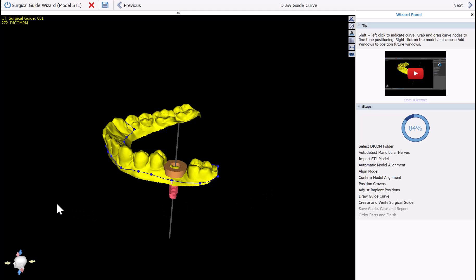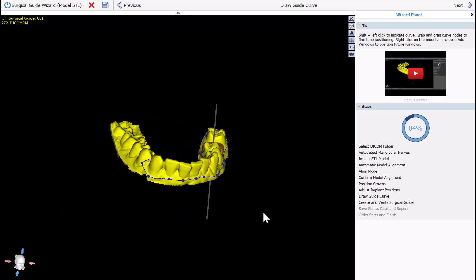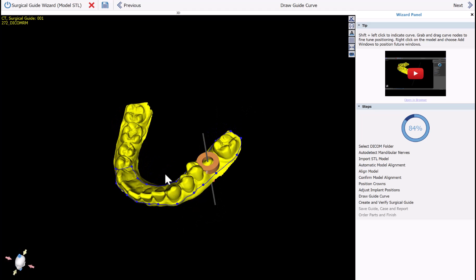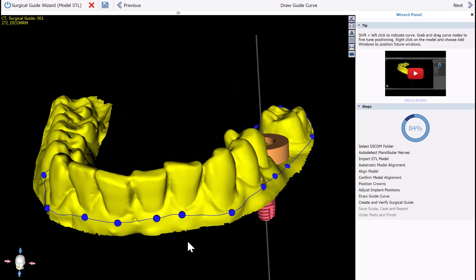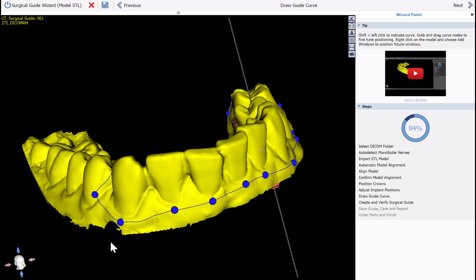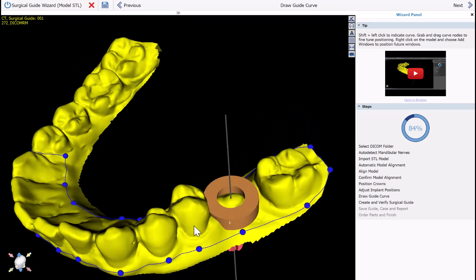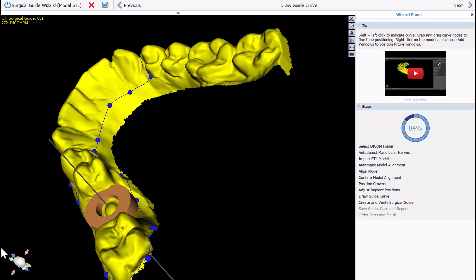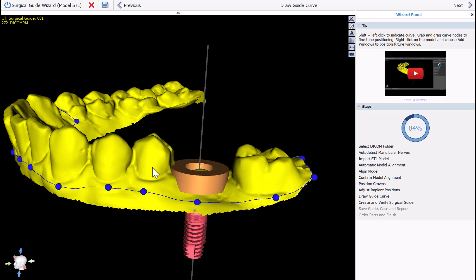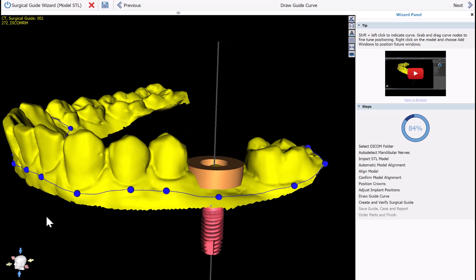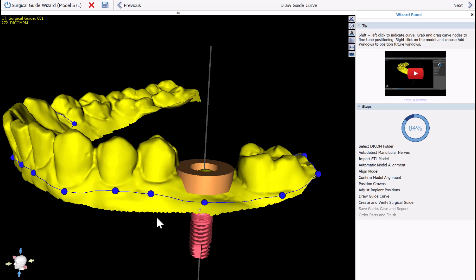Our next improvement is that the surgical guide curve has been drawn automatically. It's important to review the placement of the curve — you can zoom in and out with your right mouse button and grab and drag any of the nodes with your left mouse button to make modifications. In the Options menu you can also customize how many teeth should be included in the curve and other settings. Once you're done, simply click Next.